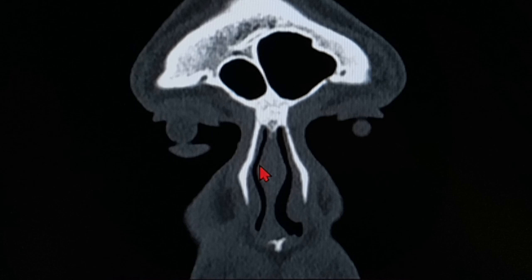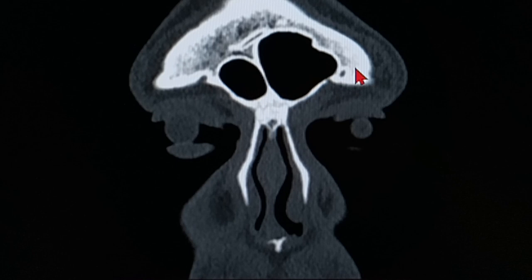So keeping on going behind, you can still see there is no brain shadow over here. The brain is not in the picture yet. This is still the bone. Once this bone is done, posteriorly you will start seeing the brain.